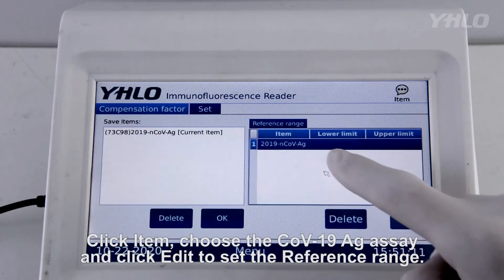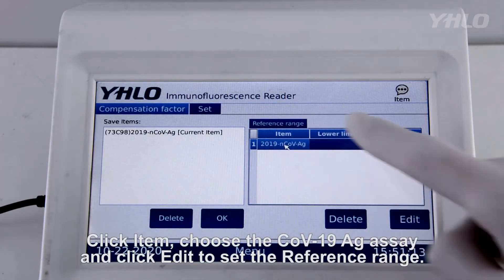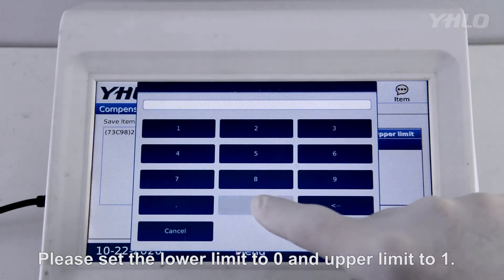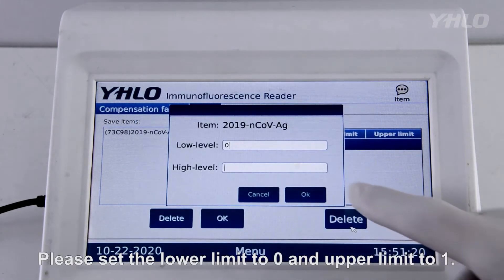Click Item, choose the COVID-19 antigen assay, and click Edit to set the reference range. Please set the lower limit to 0 and the upper limit to 1.